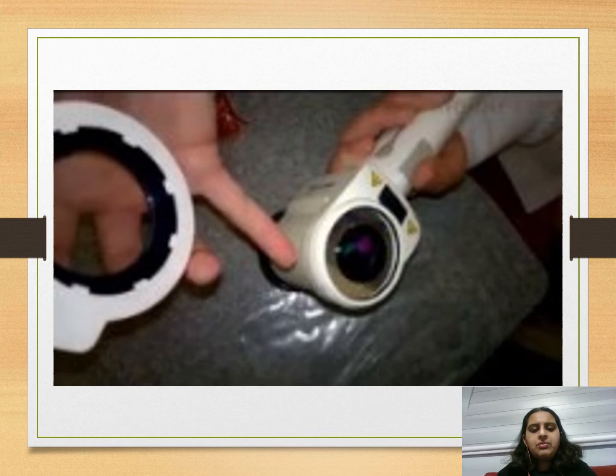You also want to make sure that the barrier is not covering the exhaust points, because you want the heat to escape, and it is a plastic barrier. They're just showing the on and off button right now. You can see that it shows it's being charged at the moment, and that's how it turns on and off.